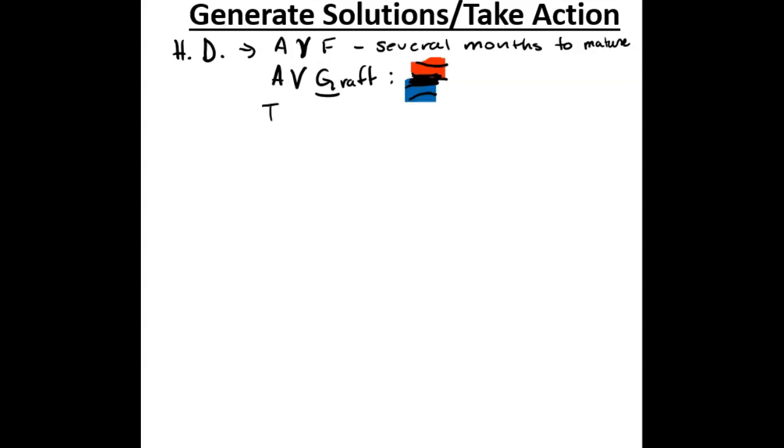And then, of course, we have the temporary access. For some folks, if they keep losing their fistula or something like that, then their temporary access really is quite long term. But that is usually placed, well, for real temporary would be the internal jugular, the femoral. For some of these folks, we have them tunneled, and you'll see them in their chest and going that way, so they're not straight in the neck. So they'll tunnel from below instead of above. So we would say basically the internal jugular or the femoral.